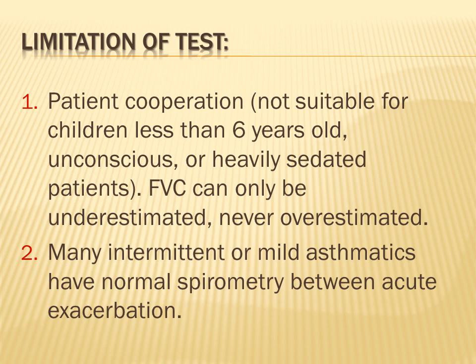Forced vital capacity can only be underestimated and never overestimated. If the patient is cooperative, the result will be successful and the value should be close to normal, or less than normal if he is in a critical case of a certain pulmonary disease. But it will never ever be more than normal. Keep this in your mind for the future.